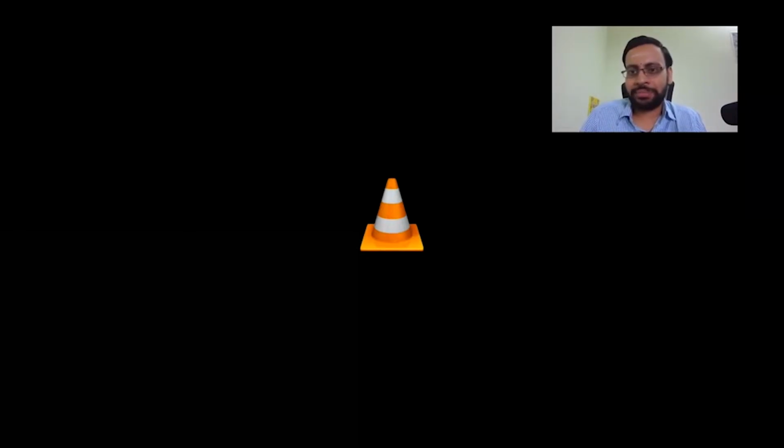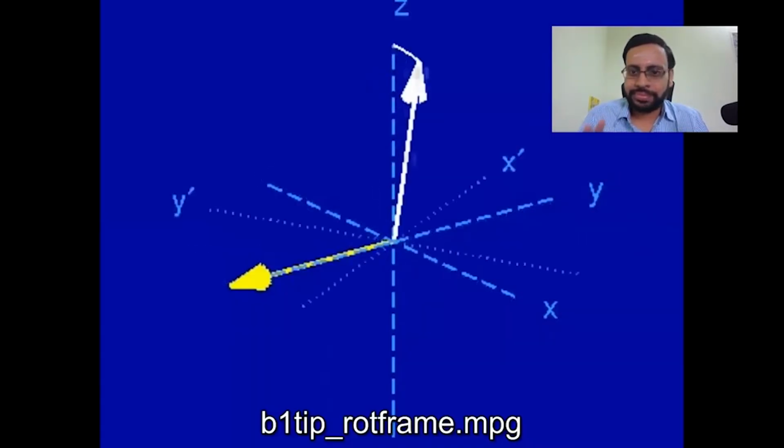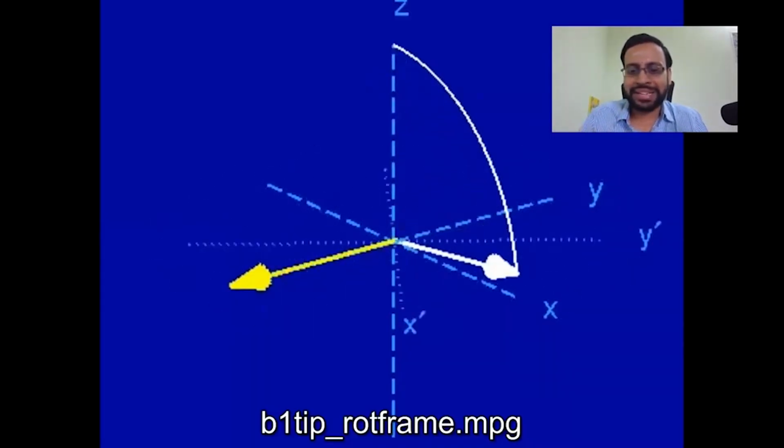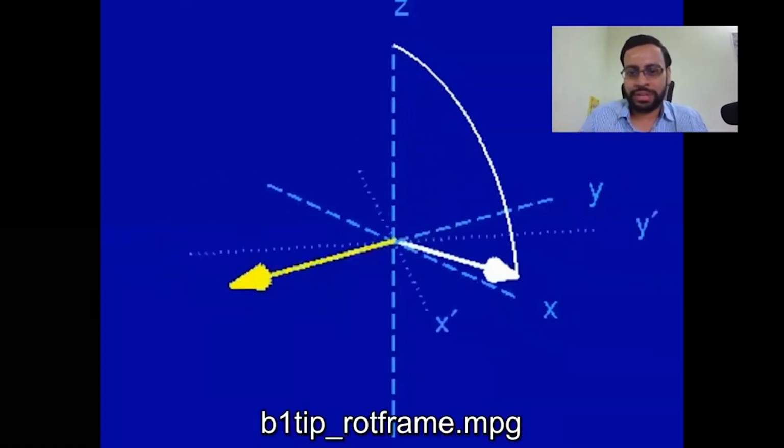Because angular velocity is dependent on what? That also we have derived, right? Omega in radians per second, gamma times B naught, would give you the frequency, as long as the applied field is constant, B naught you are applying. Gamma times B naught is the angular velocity with which it rotates. So as long as your magnetic field is constant, your velocity is constant. Okay, sir. They made a very nice illustration. Again, there are many tools also, but for us, this is good enough to get the feel of it. I hope it is clear.